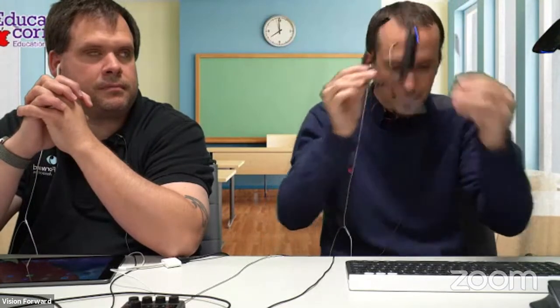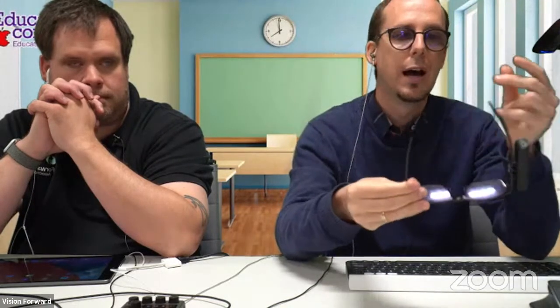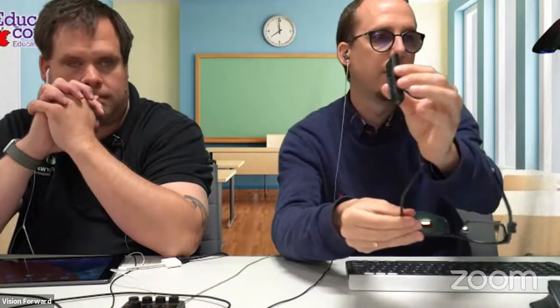They have this one, which is glasses mounted, and so this one actually goes on the side of a pair of glasses, and that way wherever you look, the camera is looking. There's a camera in the front of this. So that's pretty convenient. And then the other version, which I unfortunately don't have here, is more of a pen style. So you would hold it in one hand. It's a little bit bigger than this guy, but not significantly. It's very lightweight. And so you would hold that one in one hand.